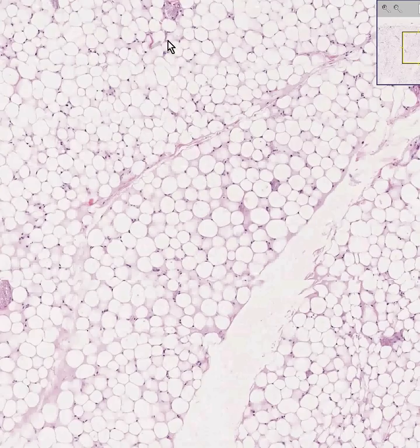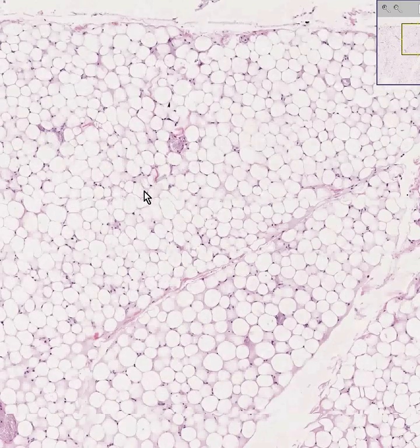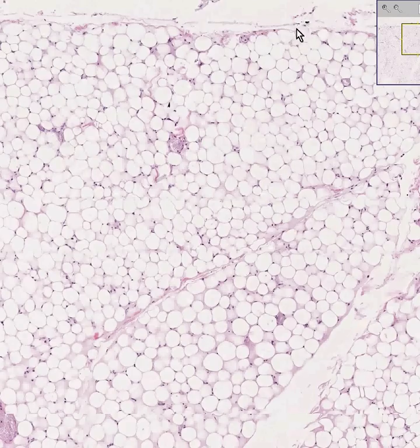Sometimes you'll see a little bit of fibrous connective tissue interspersed with it, like perhaps you see here. And often towards the edge of mature connective tissue you tend to see a few extra collagen fibers or fibroblasts as well.